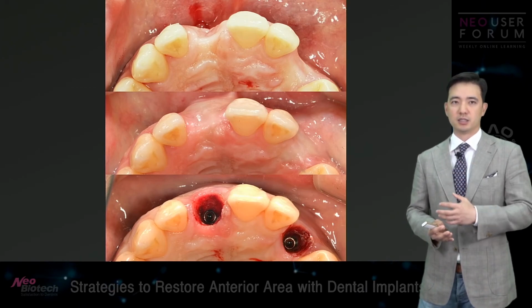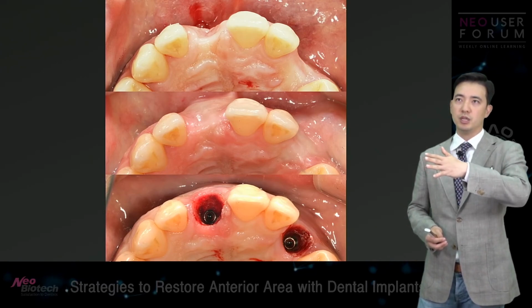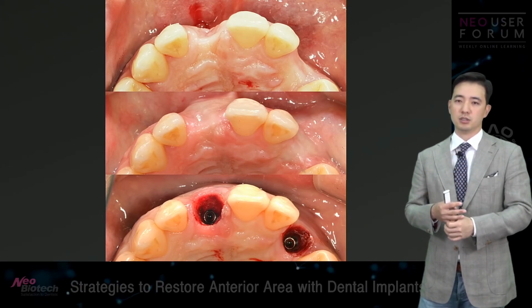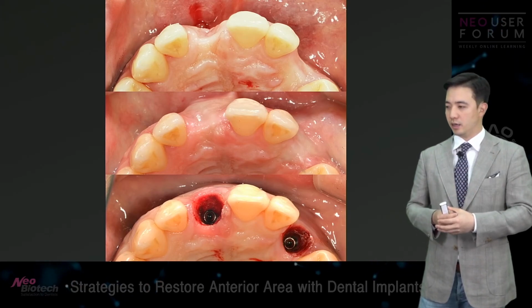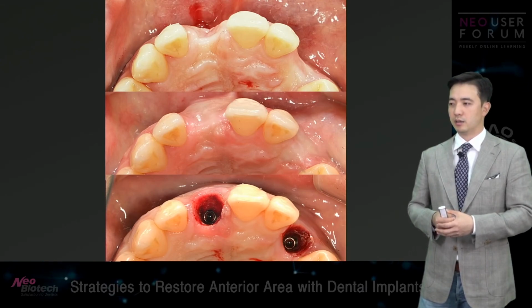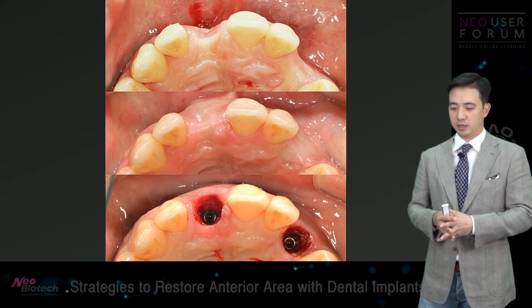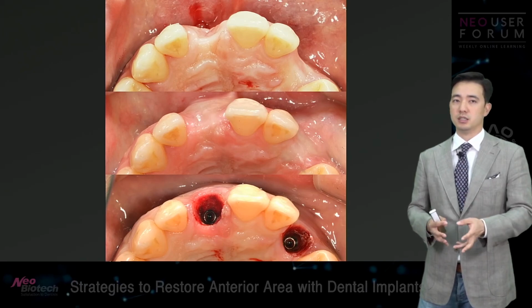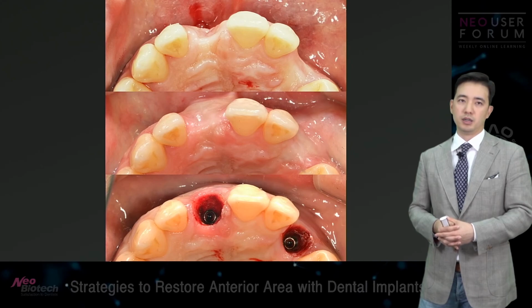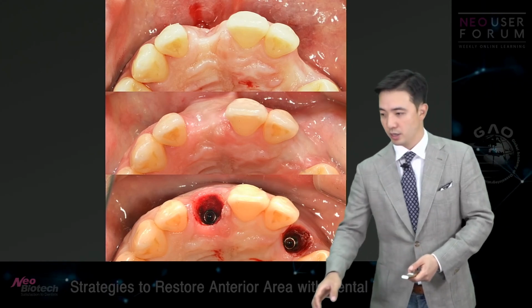So it kind of sticks into the bone, and then you can't really tell from the CT scan which part is the root and which is the buccal bone. So you can't really separate it on the CT scan. I think it gets ankylosed, so I don't really worry about the long-term prognosis after seeing that CT scan. But yeah, so far, I would say all the cases that I tried, I really didn't have any complications.